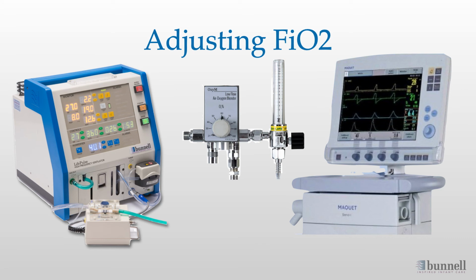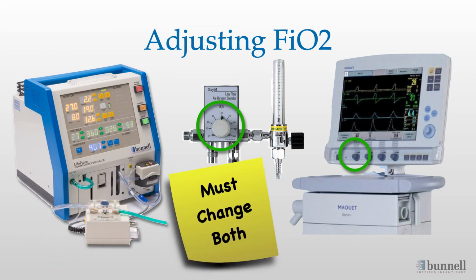The jet is plugged into an external blender in order to adjust its FiO2, while the conventional ventilator has an internal blender. The FiO2 must be adjusted on both the jet and the conventional ventilator to ensure the proper FiO2 is delivered. They must match. A quick tip, when you're new at this, use a sticky note that says, "Must change both."